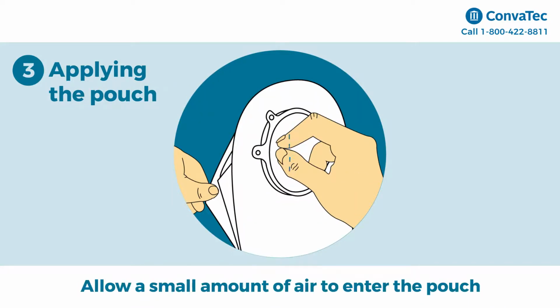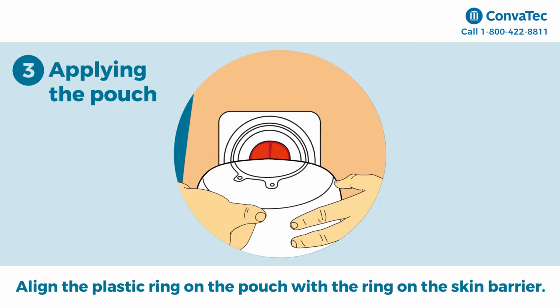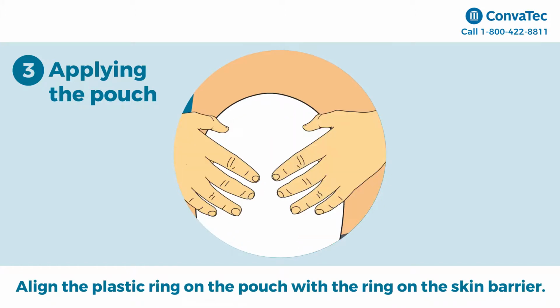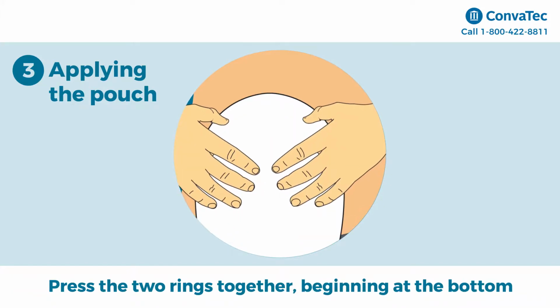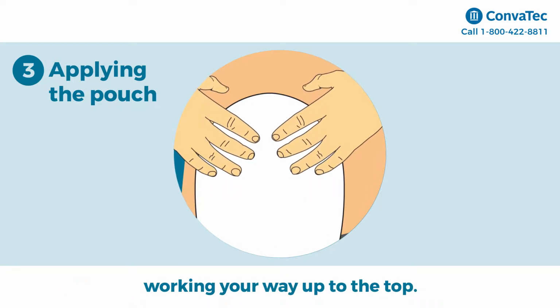Before attaching the pouch, allow a small amount of air to enter the pouch by gently separating the sides. Align the plastic ring on the pouch with the ring on the skin barrier. Press the two rings together, beginning at the bottom, working your way up to the top of the ring. Several clicks may be heard.